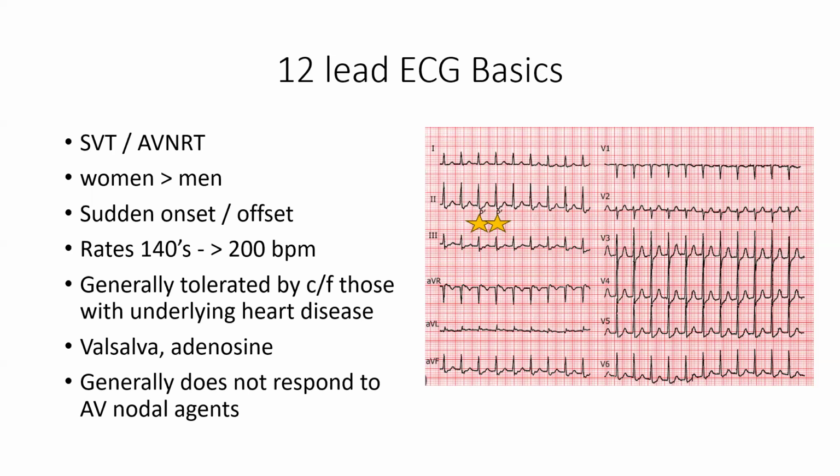Even despite those rapid rates, these patients tend to tolerate SVT. They might feel pre-syncopal, but it's very rare that they pass out from SVT. They usually just feel the very rapid heart racing.